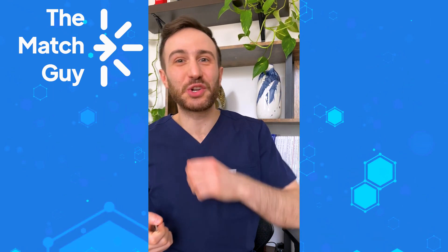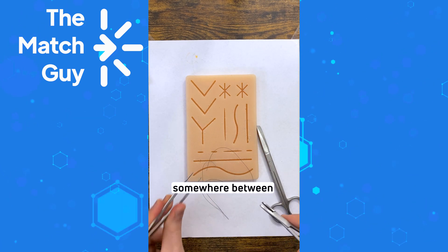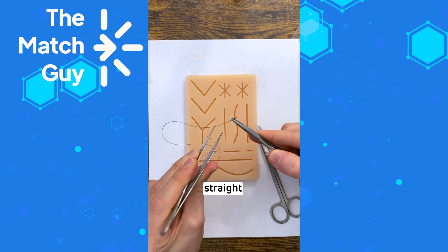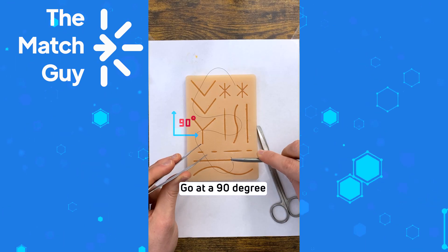Do you want to suture like a plastic surgeon? Let me show you how. First you need to load your needle. Get your needle holder, your forceps, and then grab the needle somewhere between the upper third and the middle third of the needle — either straight or angled towards the outside a little bit. Then lock your needle holder.